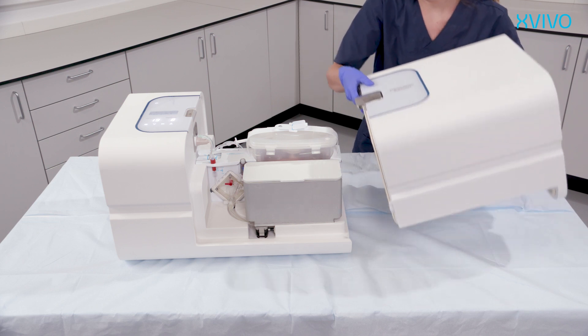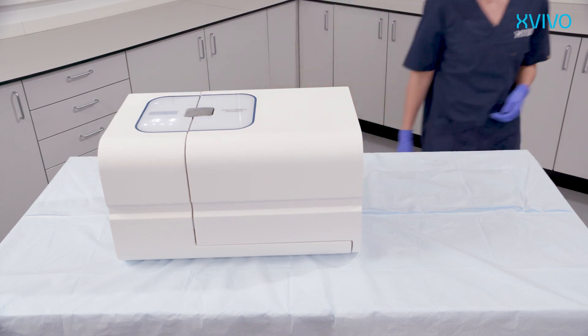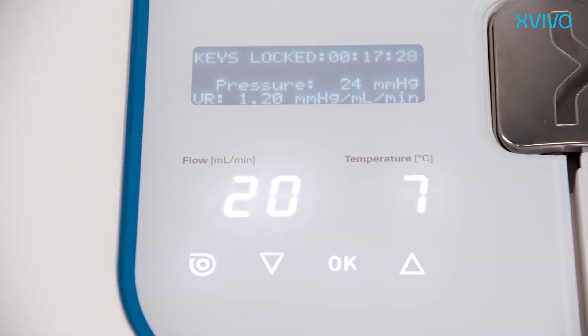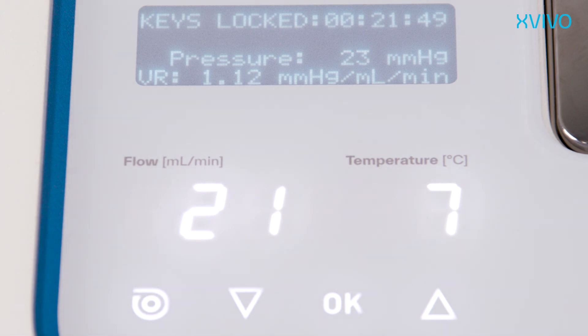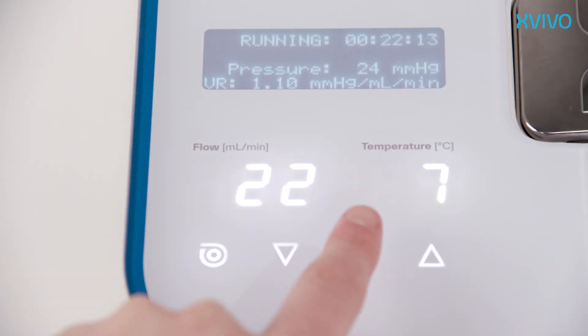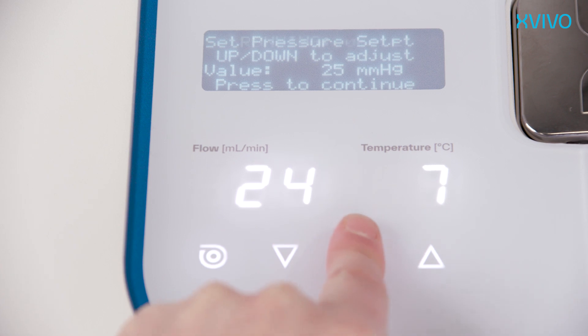Slide the cover on the device. Press both parts firmly together and make sure the lock of the cover is closed completely until it clicks. During perfusion, the measured values of flow, temperature, pressure, and vascular resistance will appear on the display. The pressure setting can be adjusted by pressing the OK button. Be aware that after three minutes, the keys of the control panel will be locked to prevent accidental activation. To unlock, press OK for three seconds and the keys will be activated again.